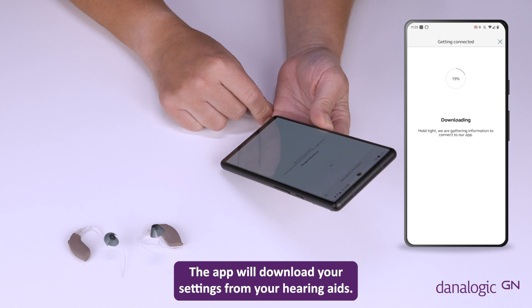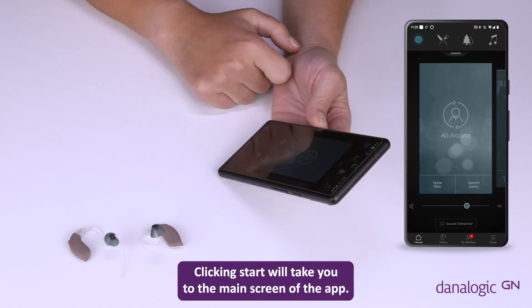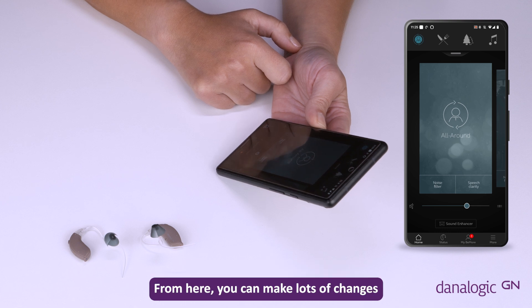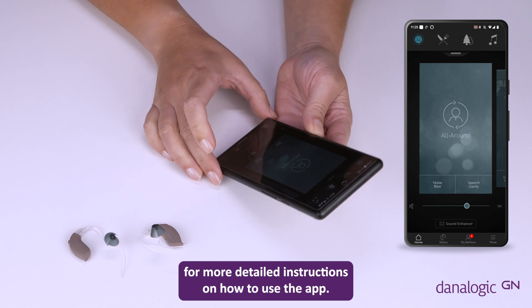The app will download your settings from your hearing aids. Clicking start will take you to the main screen of the app, from here you can make lots of changes to your hearing aids. Please see the app user guide for more detailed instructions on how to use the app.